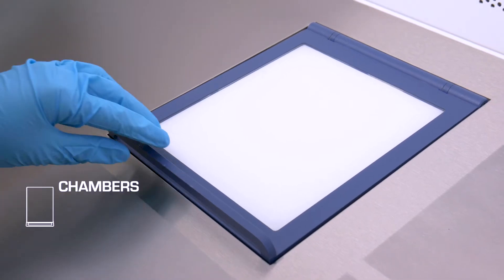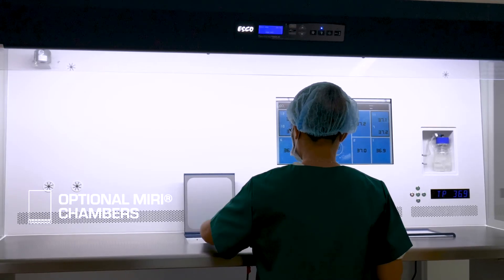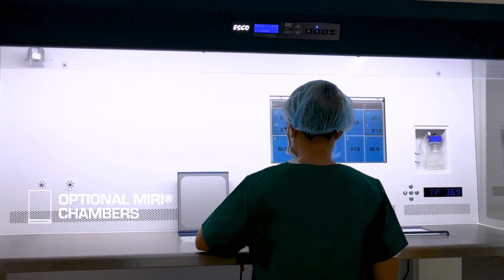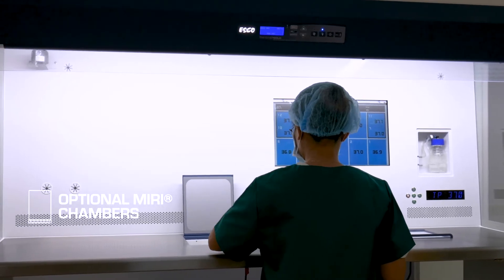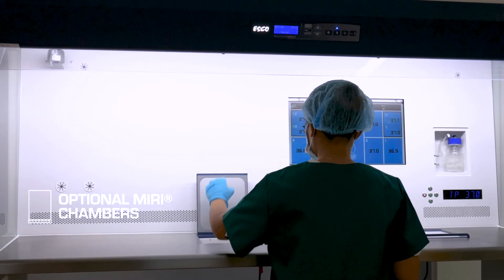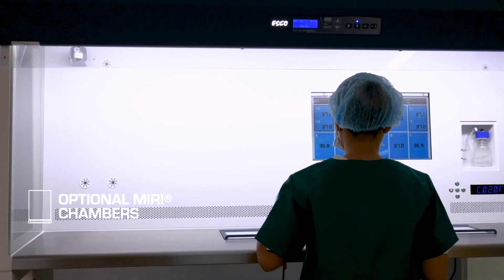You can now have the option to integrate MIRI chambers as temporary shelter for safer embryo handling. This gives an optimal workflow and a stable environment for the embryos.